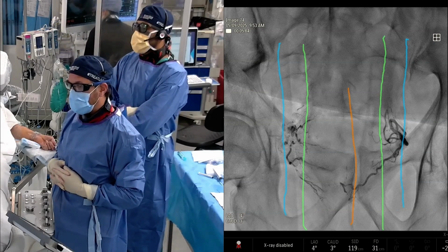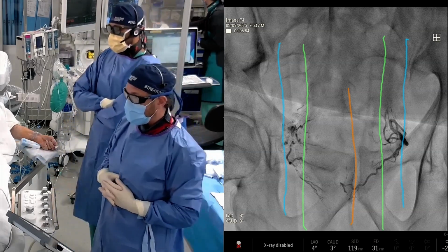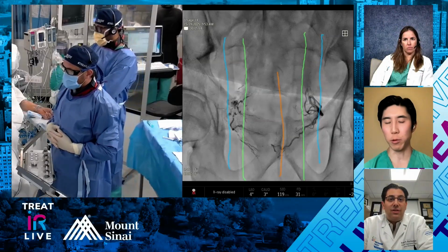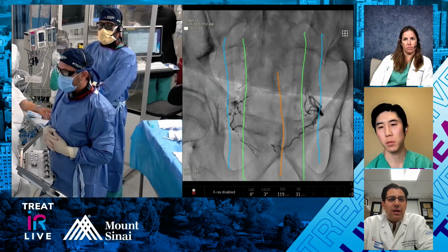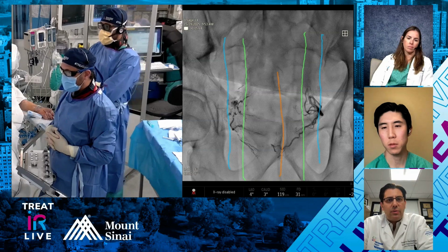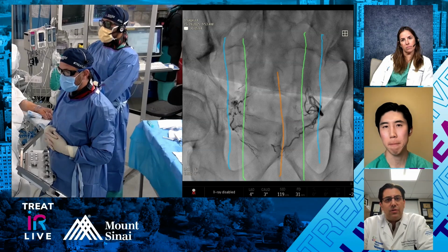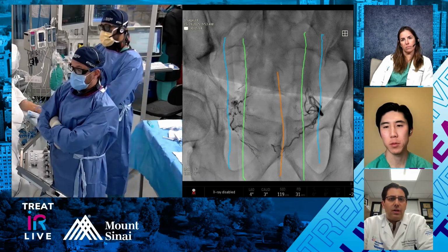And then the other thing that we like to give is antibiotics. I know there's some debate about that. Do you guys give antibiotics for a week or 10 days after embolization, typically? I do like a 3-day course. If you're not touching the urinary tract, you really have no manipulation, there shouldn't be a long-term course. Like you can do a 24-hour, you give a dose during your procedure, but I've never been using any antibiotics after the procedure unless the patient has an active UTI that we've treated right before the procedure to extend through. However, I rarely use that.